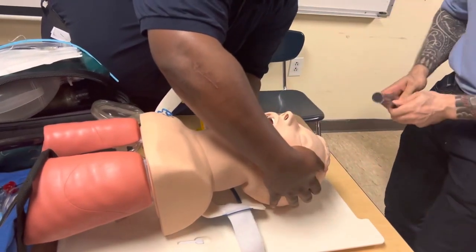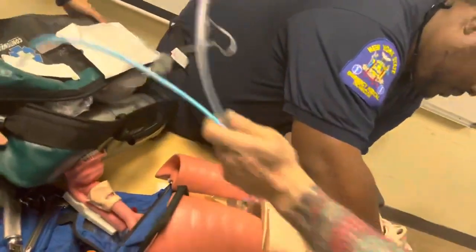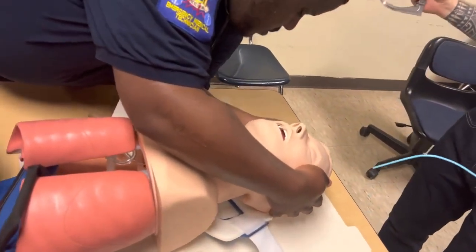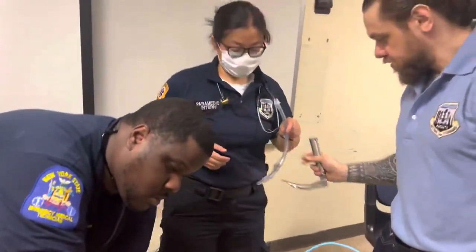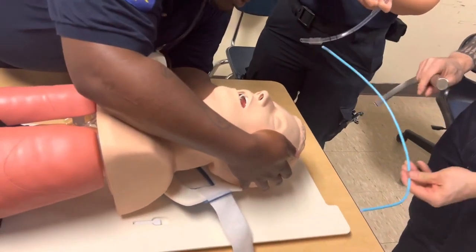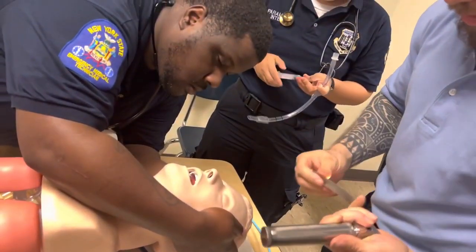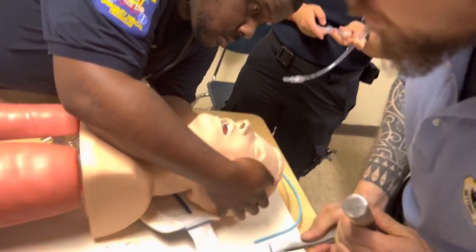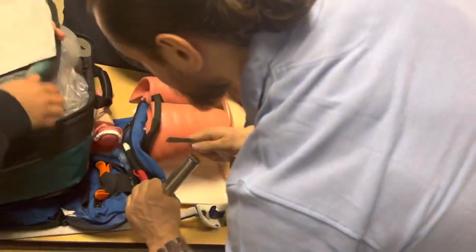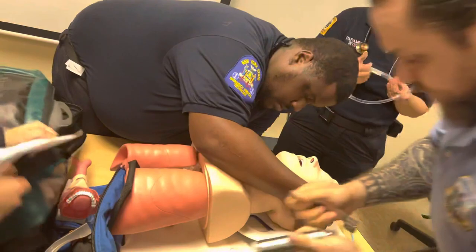Very good, right? And then what we're going to do is, Rita, you're going to be my other partner. You're going to come here, right? And you've got the ET tube, and you're going to put the syringe, excellent, right? So what I'm going to do is, I showed you, right? Actually, let me get it, it was a number 3 here somewhere. I think a 3. Yeah.